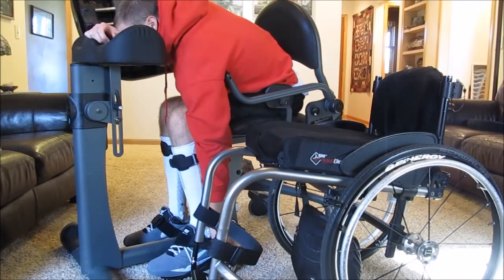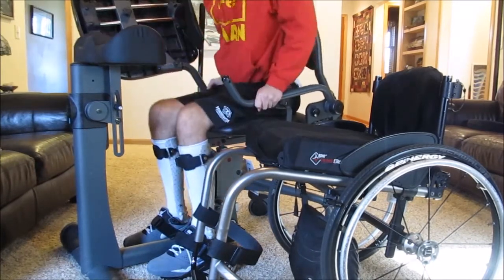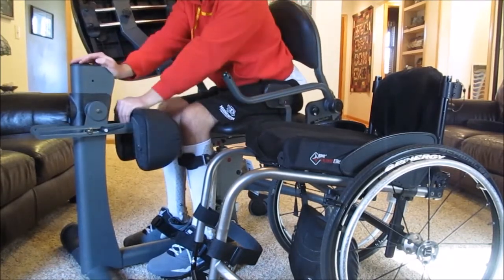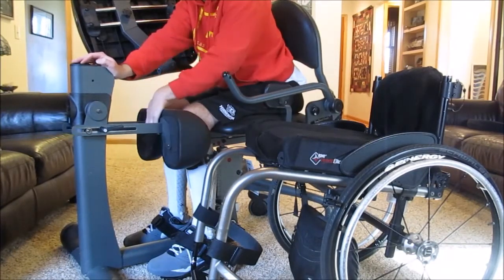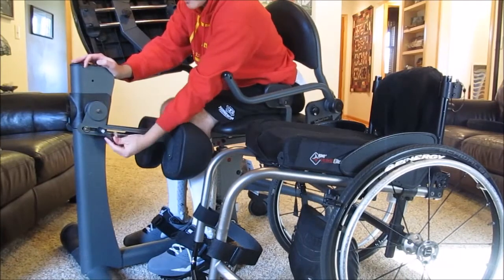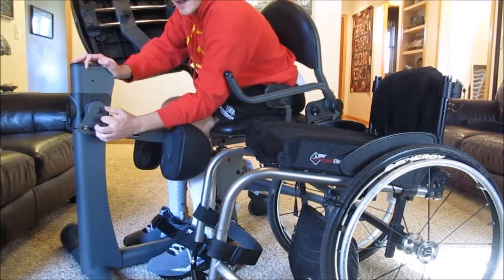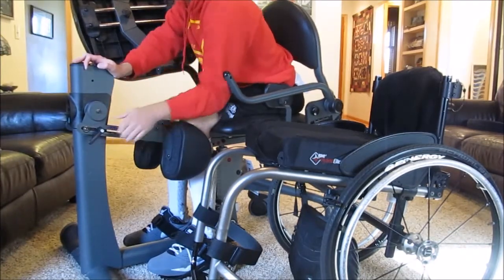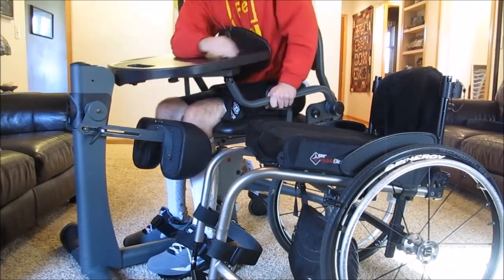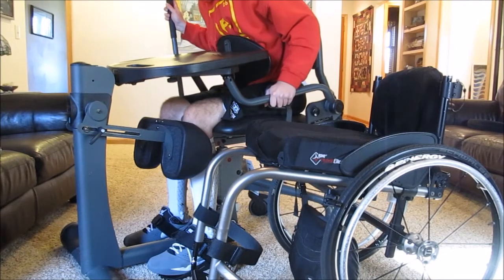The benefits of the stander are that it's good for blood flow, and it's good for your bones because they're supporting weight. It just feels good to be upright because sitting in your chair can get uncomfortable. This also helps with back pain by standing upright and just stretching out your back. I love using this — I use it for about 30 minutes to an hour and I try to do it every day.